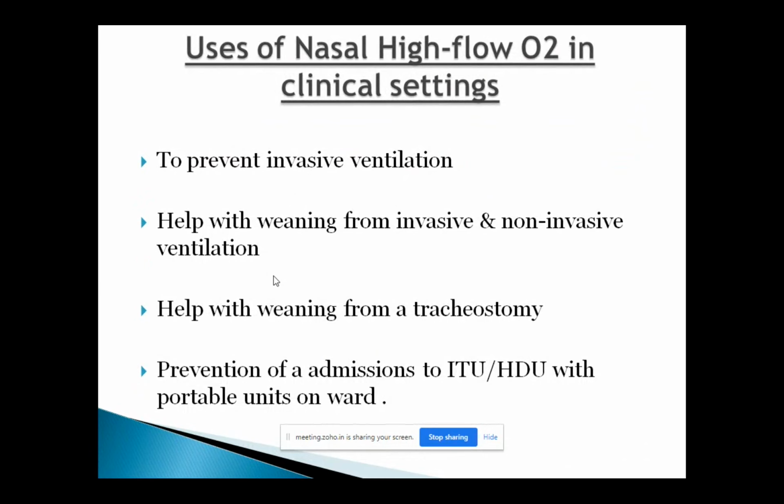Use of nasal high flow O2 in the clinical setting. What we do: prevent invasive ventilation, help with weaning from invasive and non-invasive ventilation, help with weaning from tracheostomy, and prevention of admission to ITU, HDU with the portable units on the ward. Because these devices are such portable units, you can use them in the respiratory ward or any ward with appropriate training. So these patients can be looked after in the ward.